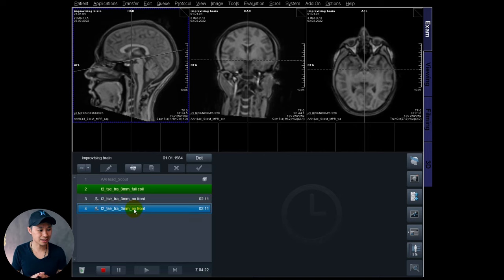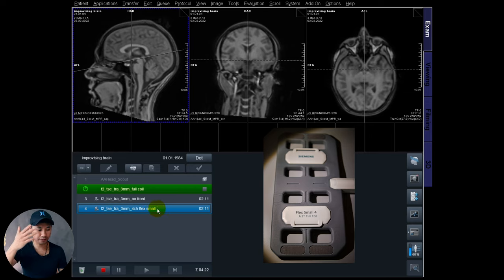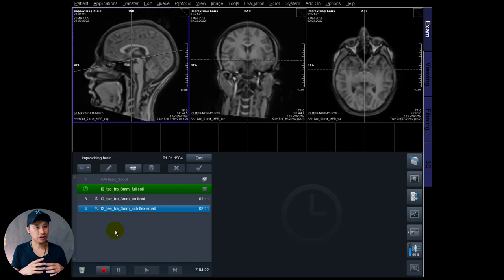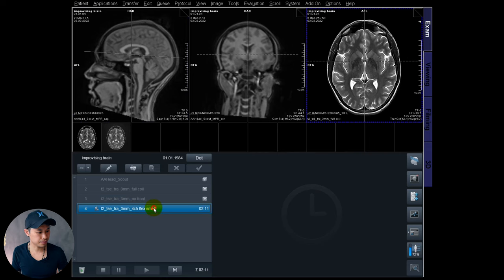The last scan we're going to do is use the four-channel flex coil — the small one — placed in front of the head. I'm going to show you how I set this up and we'll check out the images as well. Let's scan these three and then go check out the results.